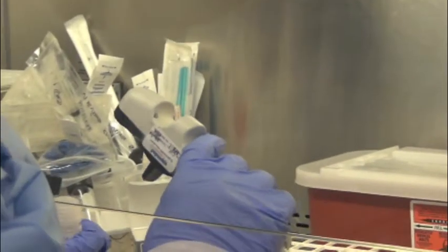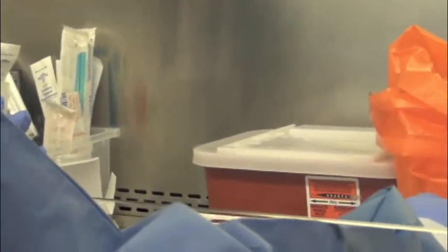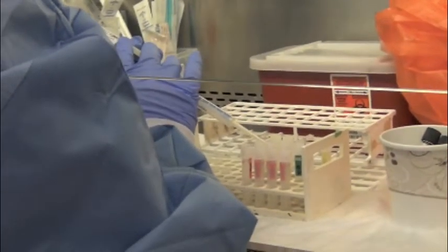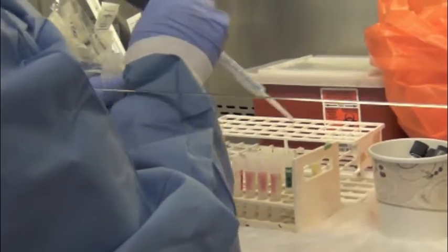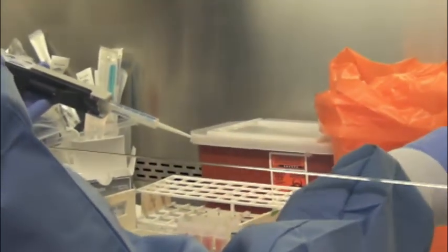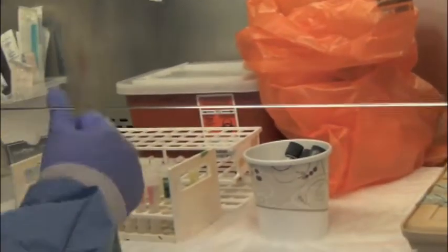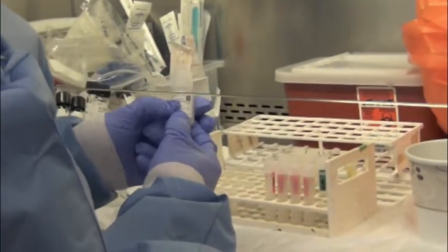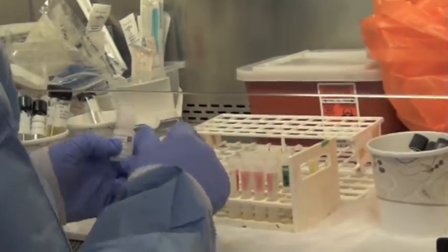Our patients are all from MGIT tubes, so that's all liquid media. If it's a liquid media, I don't need to use reagent number 2 because the liquid will take the place of it for volume. If it's a solid media like our controls here, I'll have to use reagent 1 and reagent 2.